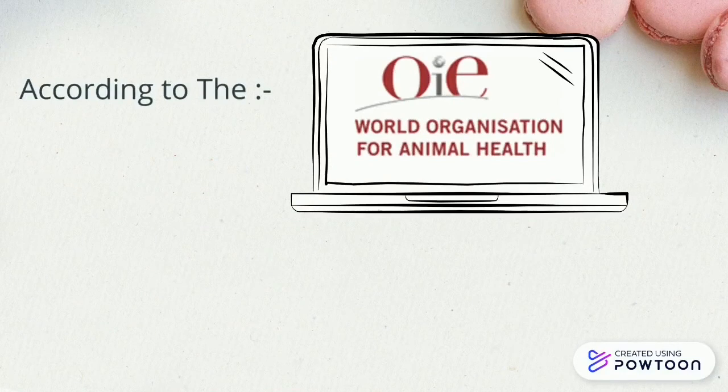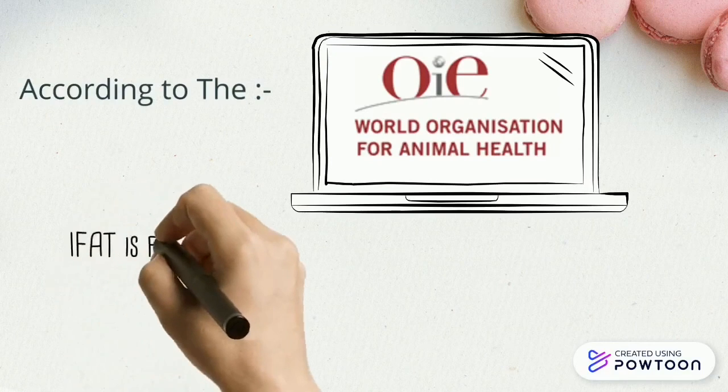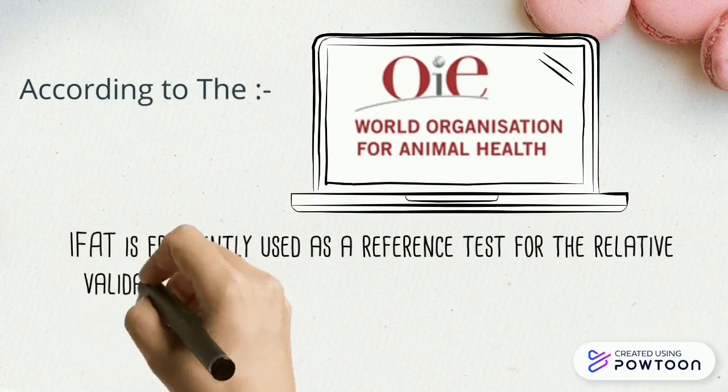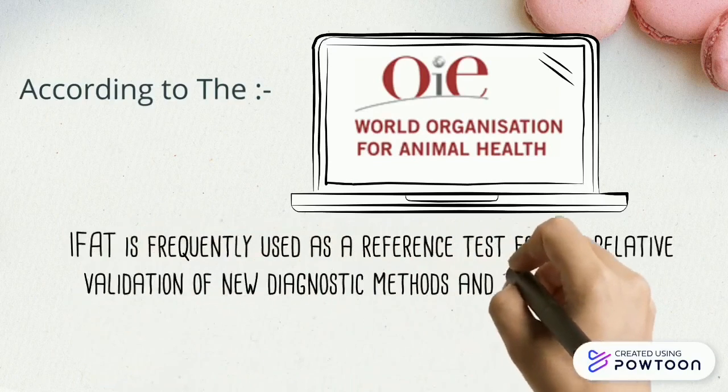Despite the fact that IFAT is not a perfect test, it is frequently used as a reference test for the relative validation of new diagnostic methods and to estimate the true canine leishmaniasis prevalence.